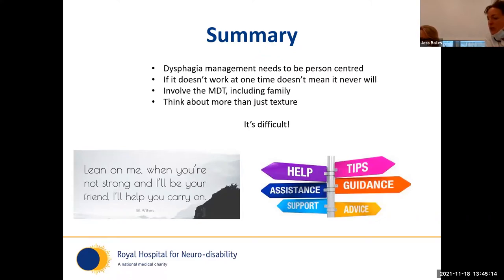I think potentially we would also do FEES, looking at oral intake in PDOC, depending on the person. Yeah, because we want to think about quality of life outcomes. And remember, oral intake can be a real social element as well, and thinking about the family. Those of you that have read the updates to the PDOC guidelines will find more information there. But think about whether it benefits them to have oral intake, and what the risk associated with it is. If people can engage with the oral intake, it would be relevant.